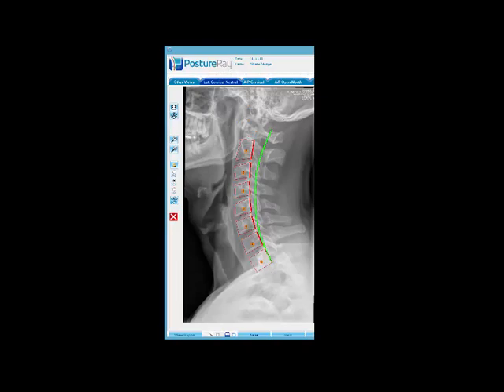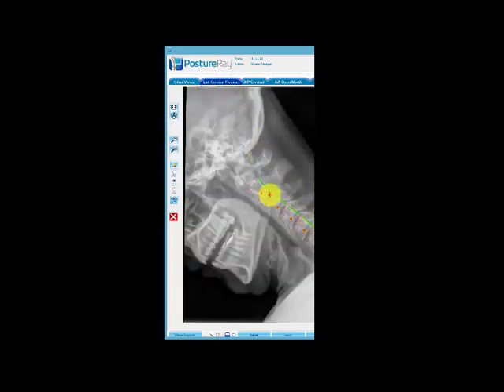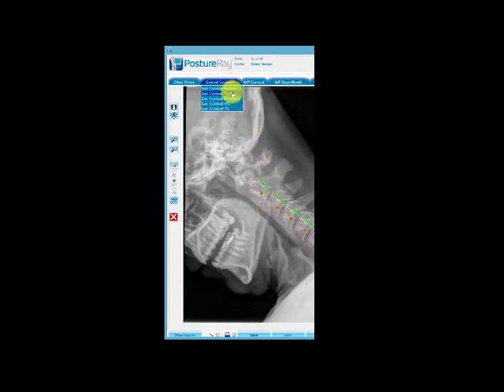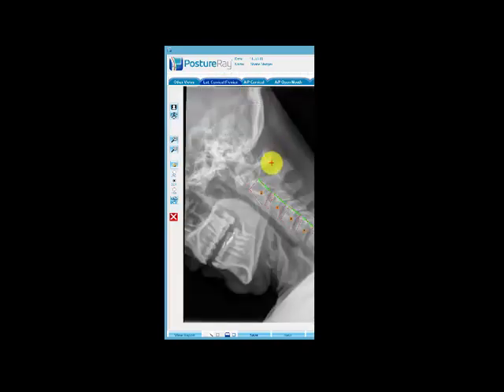We've finished ruling up the x-rays and we're going to analyze them now. This is the lateral view of the side of my neck — this is the jaw and the back of the head. The green line represents a normal cervical curve and the red lines show where my spine is sitting. I've got a reasonably good curve. The head is slightly forward-shifted. When we bend the head forwards we're looking for a smooth bending, and what I can see is that C2 doesn't want to bend forwards on C3 — it's quite flat — and these gaps in the upper neck aren't opening.